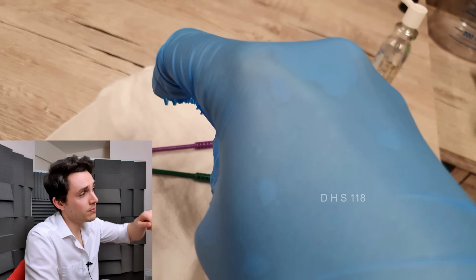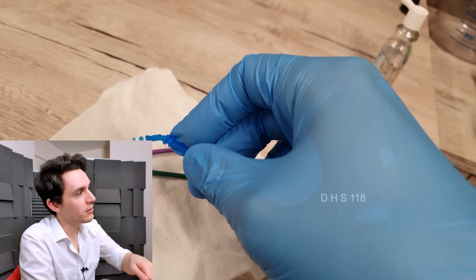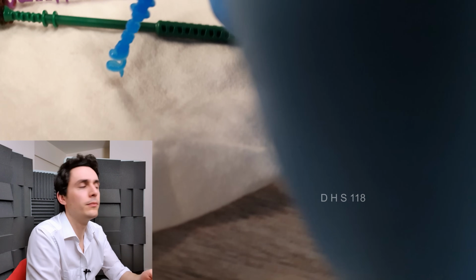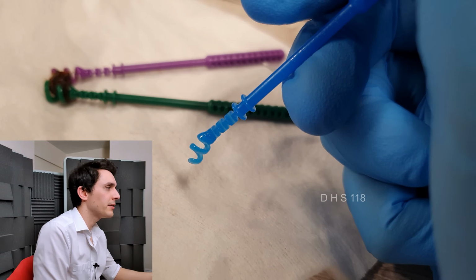So, if you want to get the device in there to retrieve most of the wax, then you want the device to bend a little bit and be malleable. So that's the first case. I'm going to show you one more case.